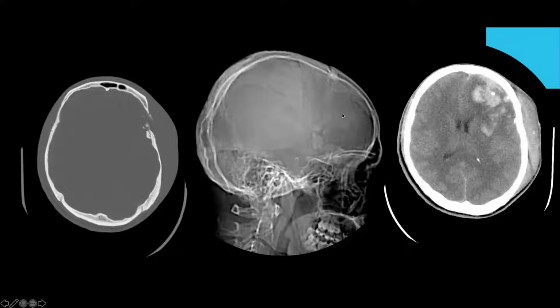So the point is, the skull X-ray is basically a waste of time if you think that somebody had a severe enough head injury that they need some form of imaging. You need to get the neurosurgeons on board and get them a CT scan.